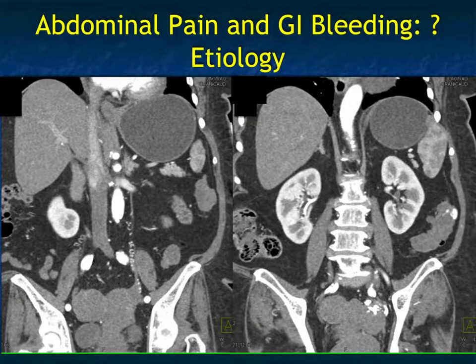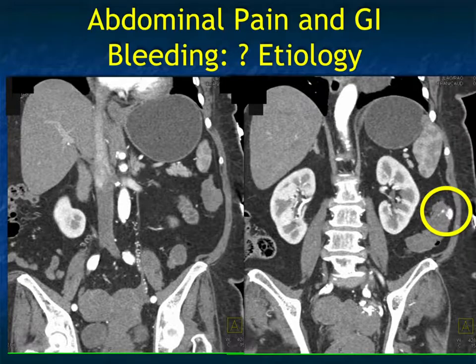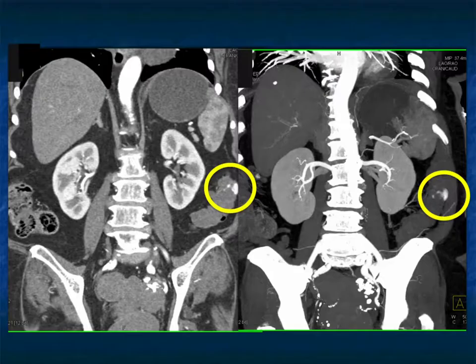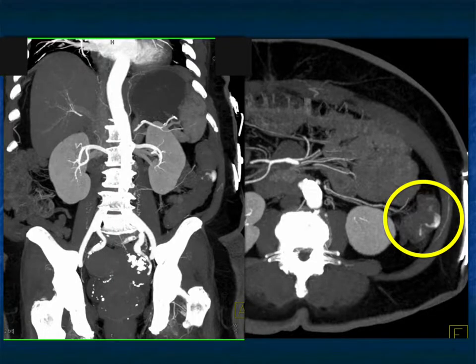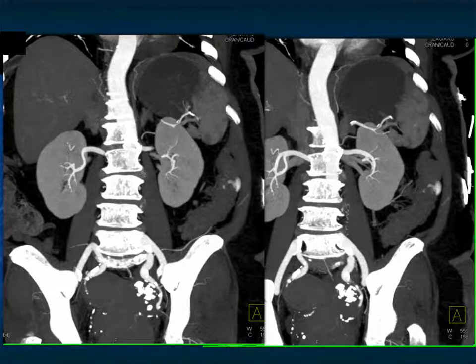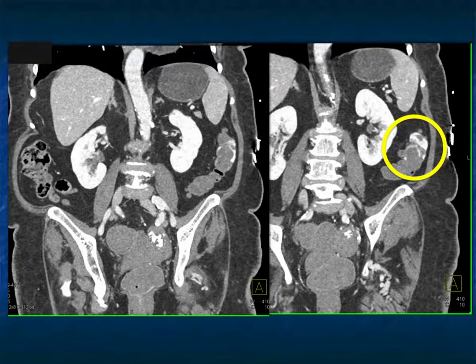Another case: abdominal pain, GI bleeding. You can see the patient's left colon — there's a bright blush, which is bleeding, and that's due to diverticular disease in most cases. Very nicely shown on the coronal views and also on the MIP. The point: axial, coronal, 3D imaging. When you're looking for a bleed, volume rendering is very good, but thin-slab MIPs may be more helpful. As you go from arterial to venous phase imaging, the bleeding becomes even more impressive. Our typical injection timing is about 35 seconds arterial and 70 seconds venous. The venous phase imaging just shows the bleed a whole lot better.